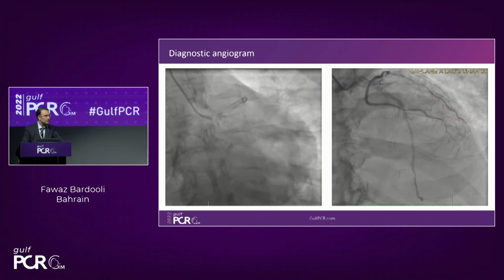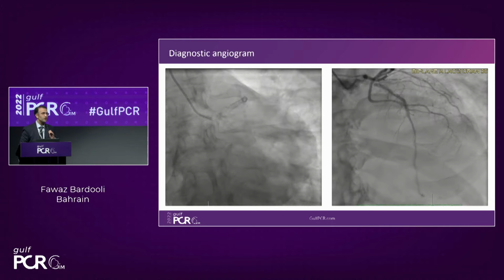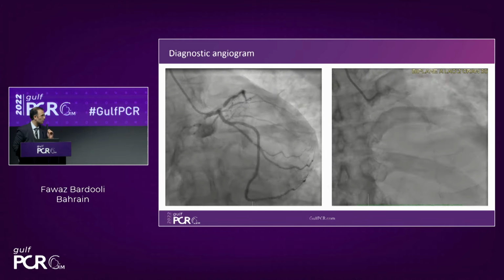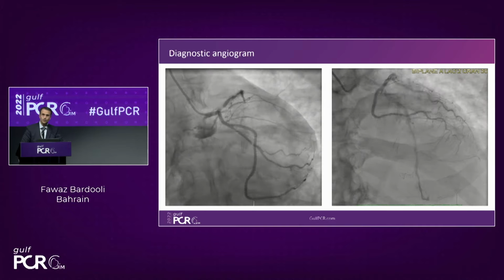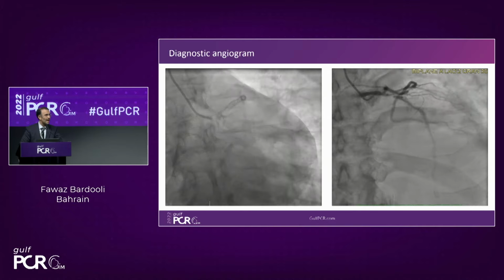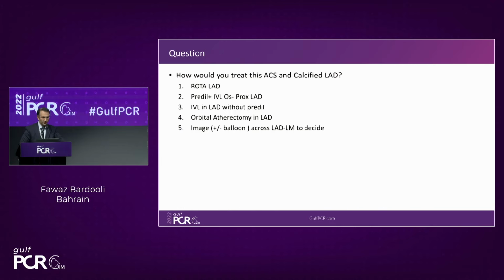If this is your patient, and this is going to be an interactive session, it's not going to be from me only. It has to be from me and for me as well. So I need to hear from you. If this is your patient, how would you react? I need you to kindly grab your mobiles, and with the barcode, what would be the option that you would choose if this is your patient?